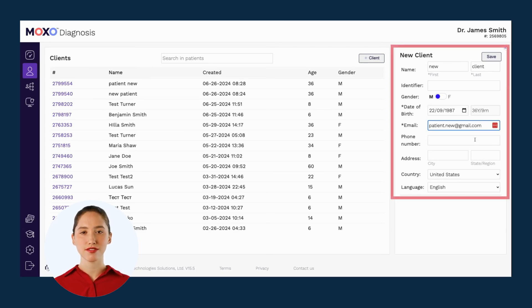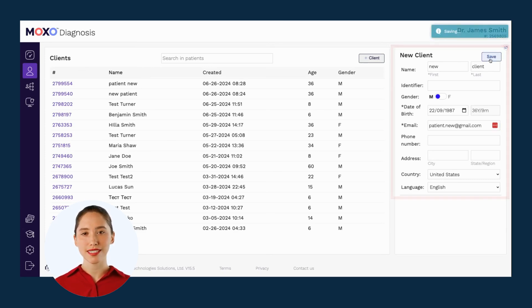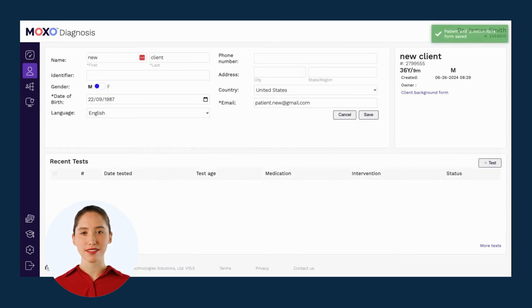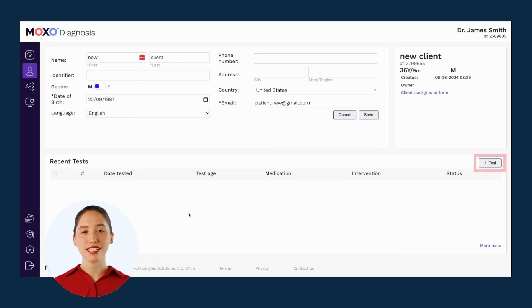Once you fill out the client's information and click save, that client will be saved into your account and you can then assign them a test. In order to add a test, you need to click on plus test.